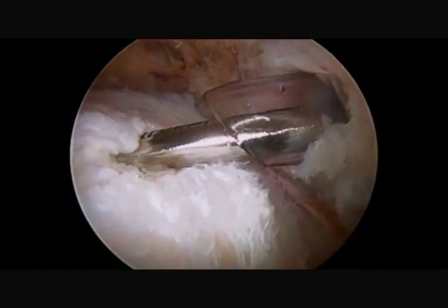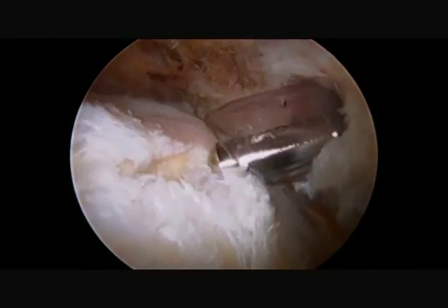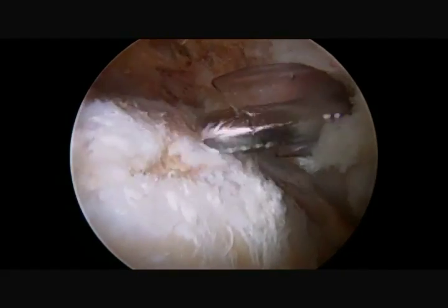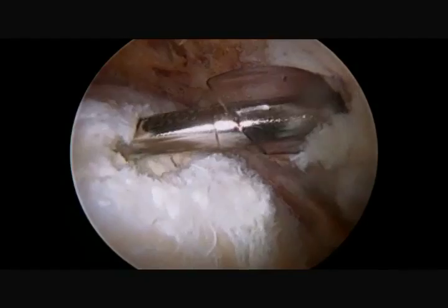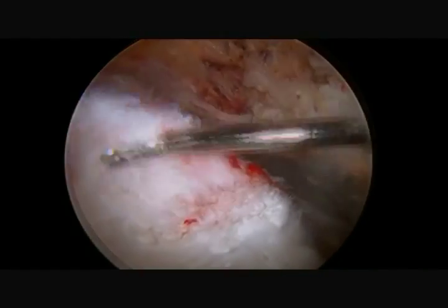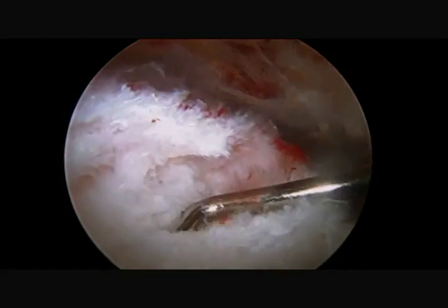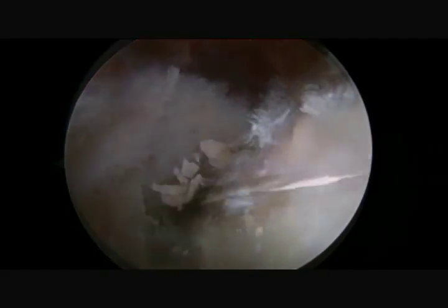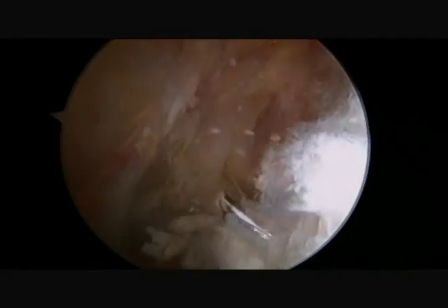Care is taken when debriding the calcific debris to only remove the diseased tissue and leave as much of the normal rotator cuff tissue as possible. If the disease is extensive and invades too much of the rotator cuff, a rotator cuff repair is then completed. This was not necessary on this patient, as the rotator cuff is probed to ensure there is no remaining calcific deposit and to evaluate the integrity of the remaining tendon.